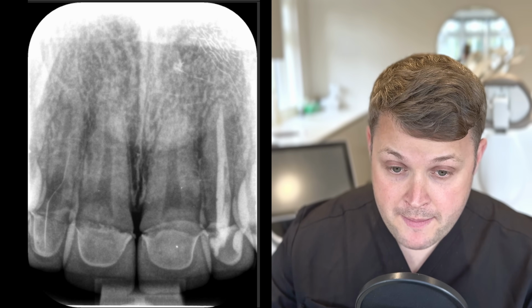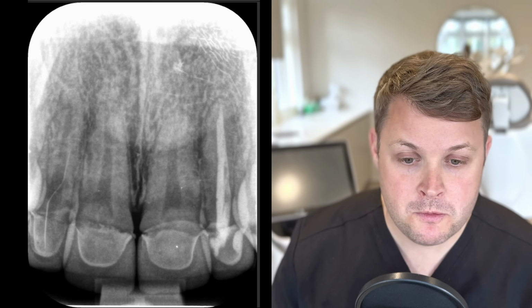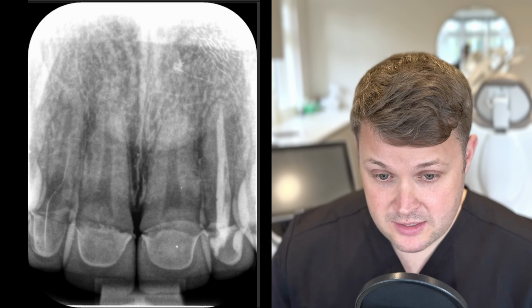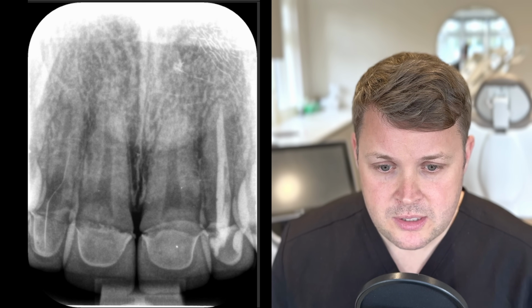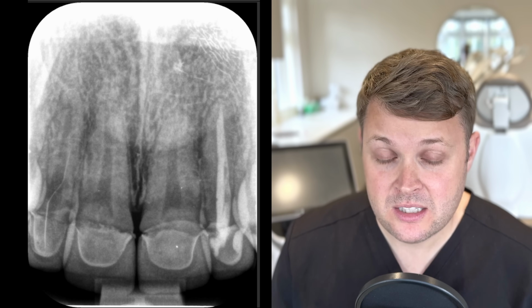And when we look at the periapical radiograph, there are a few things that I'm slightly concerned about. The first one, of course, is to access through the crown. We're going to make sure we don't perforate the tooth. The second thing that I see with this x-ray is that it's quite wide, so to obturate this tooth is going to be relatively difficult. I suppose in a way you could argue as well that the coronal third, maybe the pulp chamber isn't as large, so accessing this tooth is going to be difficult to reach down.